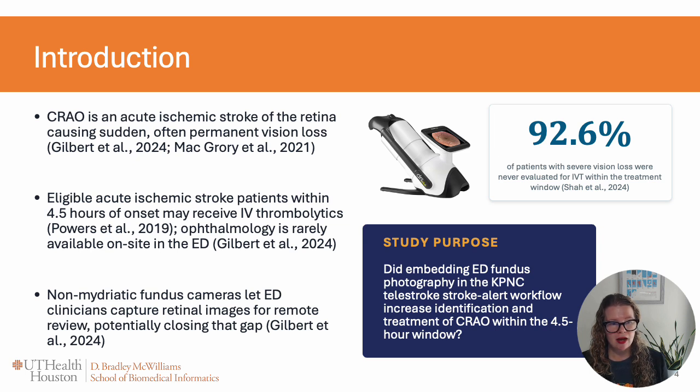So here we rolled out fundus cameras into the ED settings to allow clinicians to capture retinal images, which therefore could be immediately uploaded into the electronic health record for immediate evaluation by ophthalmology.